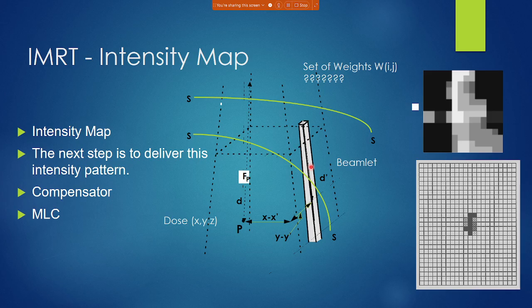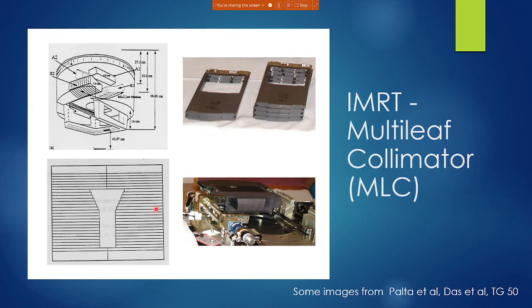Having made beamlets, they close the beamlet with an MLC or open it. So they can make small beamlets. So each beamlet can have a weightage. So at each point you can change the dose intensity. So this is actually the beamlets that have been made. For example, here the intensity is less. Here the intensity is slightly more. Here it is much more. So this is a much better method, and it's easy to do the calculation also on that.